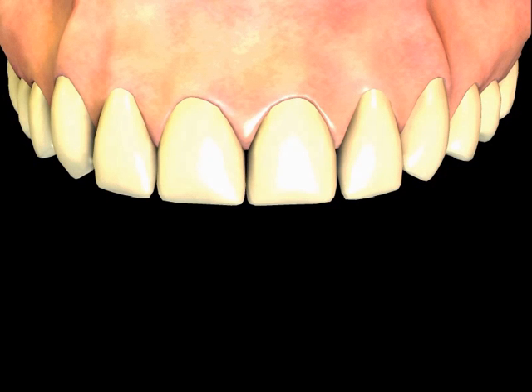Crowns or caps can be used to change the shape or color of teeth. They are especially useful when the tooth has been weakened by decay, fracturing of the tooth, or by previous root canal therapy.